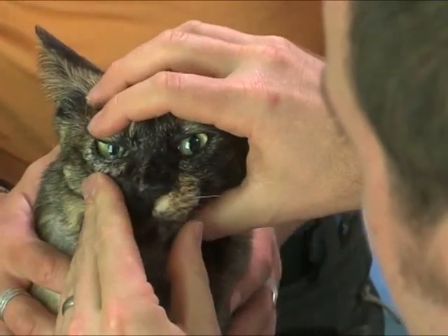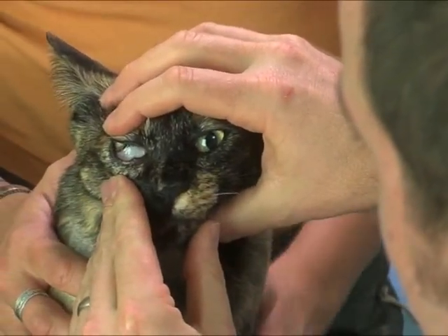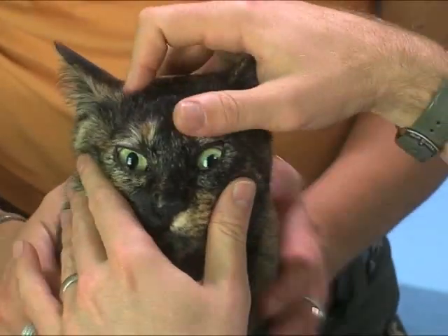Both eyes should always be examined and compared. Eyes are great because most animals have two of them, and you can use the good one to compare to the bad one and vice versa. Is what you're seeing in one eye normal or abnormal? Look at the other eye. If you see, for example, a distichiasis hair in one eye and you see a distichiasis hair in the other eye, but only one eye is painful, you don't assume that the distichiasis hair is necessarily the cause. There may be something new.